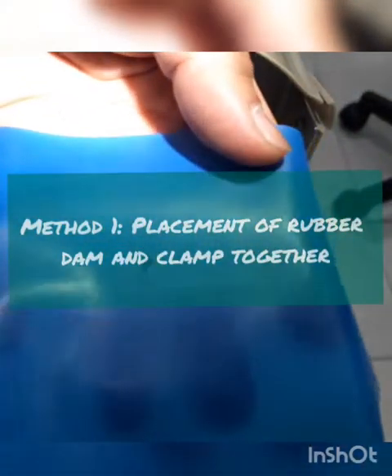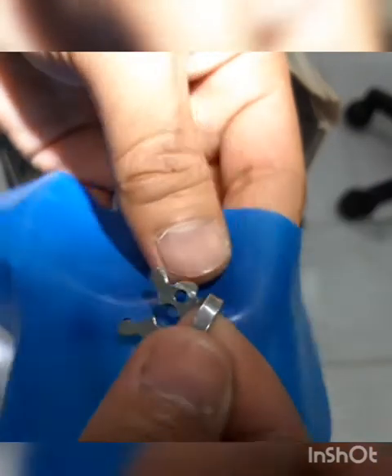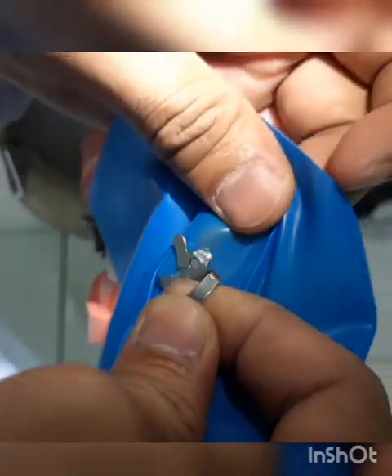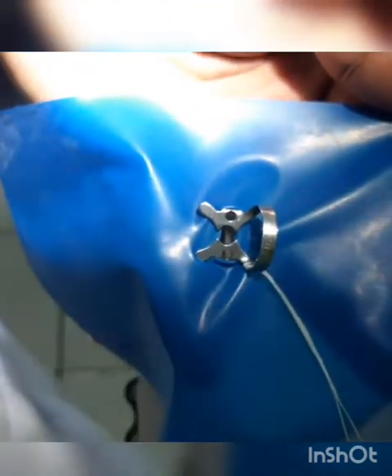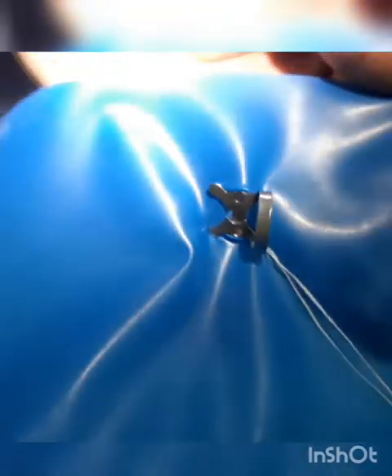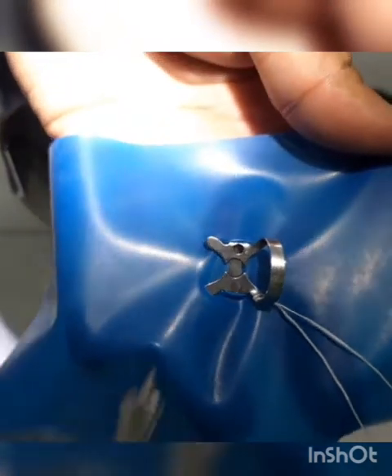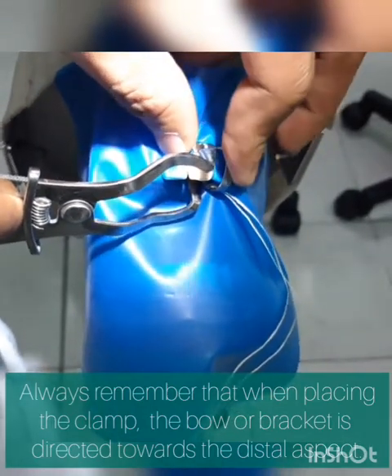Method 1 in rubber dam isolation: we place the clamp together with the rubber dam. Using the central wing, we secure the rubber dam sheet onto the clamp. Make sure that the rubber dam clamp is perpendicular with our rubber dam sheet — this prevents wrinkling when we place the rubber dam sheet on the involved tooth. Using our rubber dam clamp holder, place it on tooth 21, labial first and then followed by the lingual.